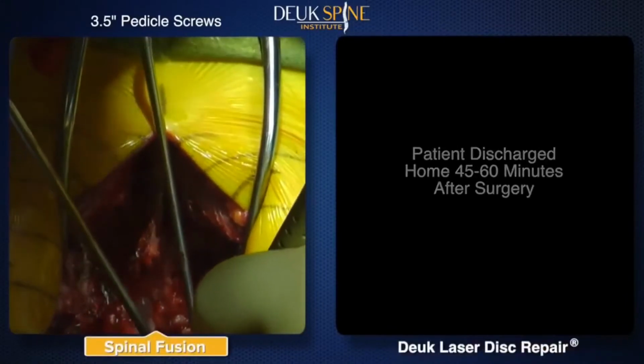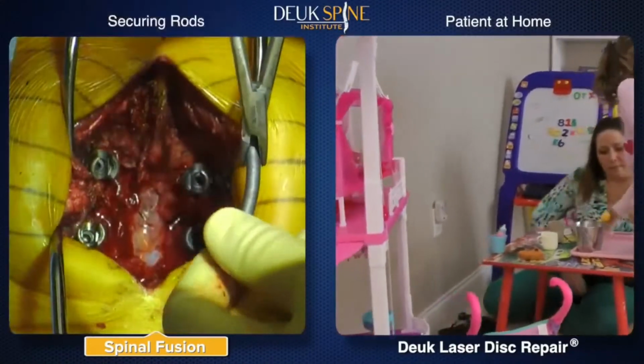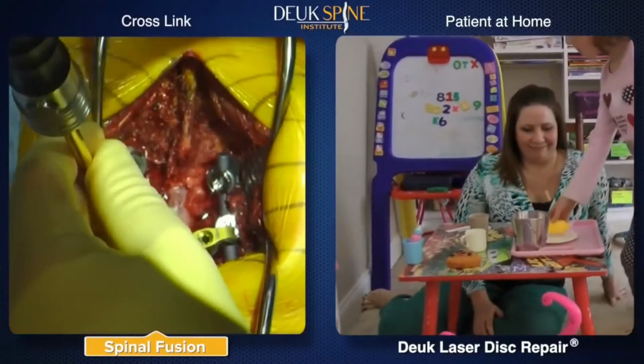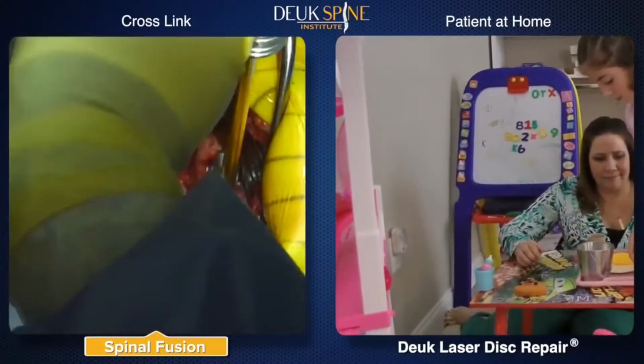The fusion screws are inserted into the bone, as shown in the X-ray. After all screws are in place, rods are used to connect the screws together to prevent movement of the secured vertebrae. Cross-links are added to bridge the rods together for additional stability.